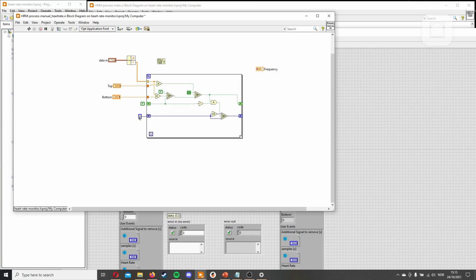And now we get how many times it has triggered, i.e. how many times the heart rate has passed a certain point. But this is not enough. We don't want the number here. We want this based on the frequency.